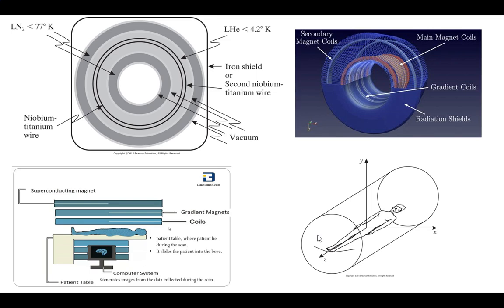But this is the one called the coils. Patient positioner, truly this rotates around, and that's what they're trying to show there. The patient positioner doesn't cut into it, they really go all the way out. And the important thing from this one is that Z is pointing towards the feet when you're looking at those. All right.